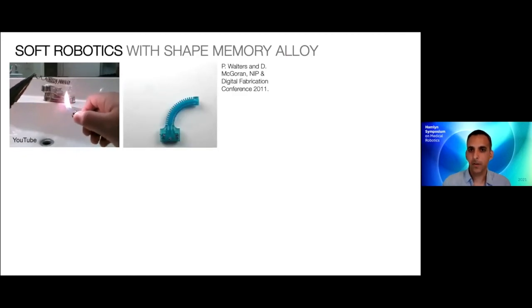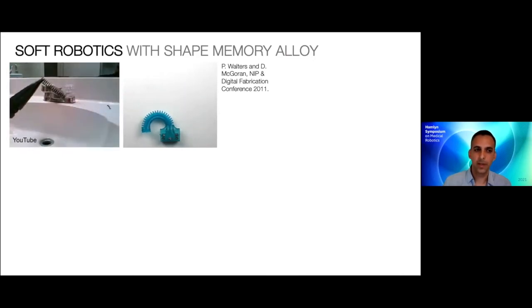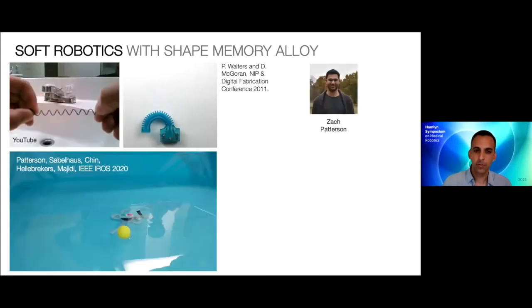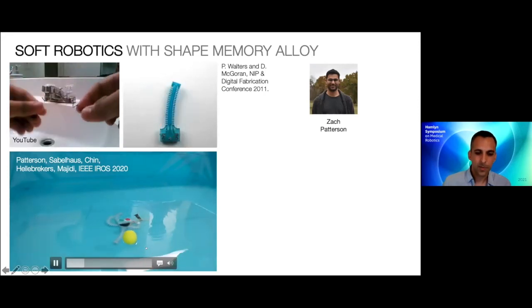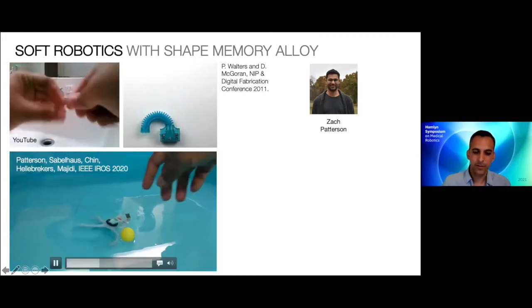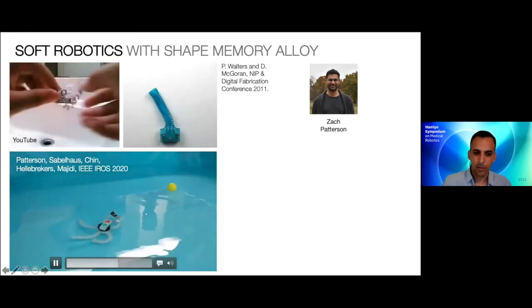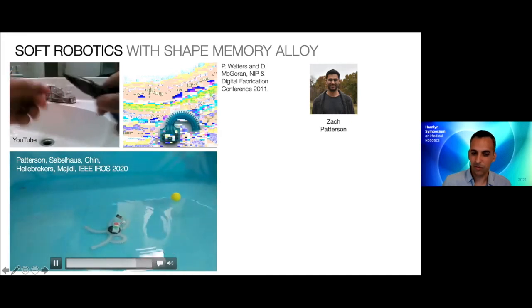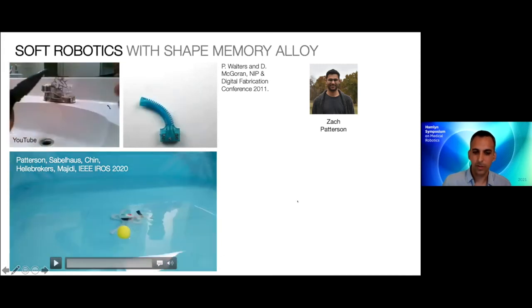I want to credit folks at the University of Bristol in the UK who did a really nice implementation of incorporating these coils of shape memory alloy into this kind of soft robot actuator. This is the approach we've been adopting in a lot of our designs. Here's one example of a starfish-inspired untethered soft robot that has an onboard battery and shape memory alloy powered limbs that allow it to move around. This video is in real time, by the way. The ability of this robot to track this ping pong ball is done with the aid of an offboard camera, so there's closed loop control here.